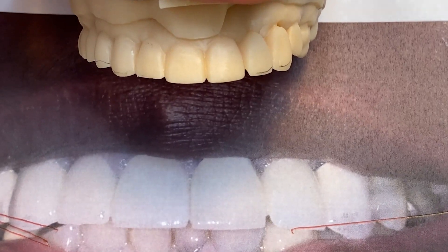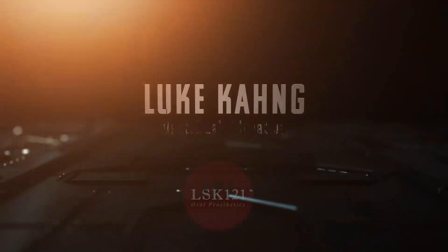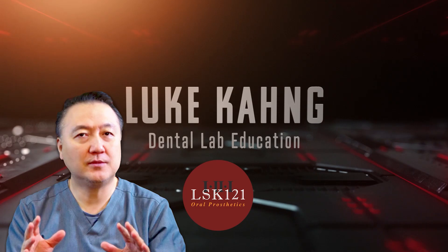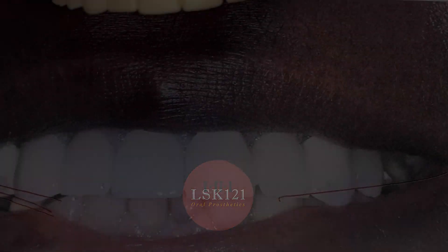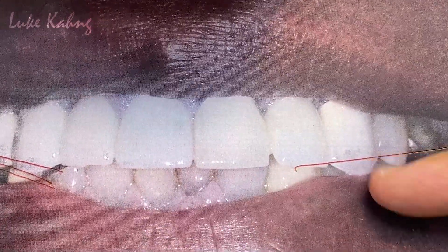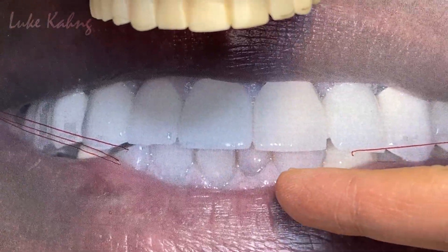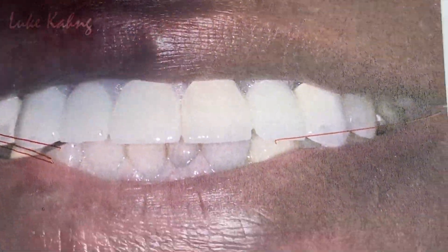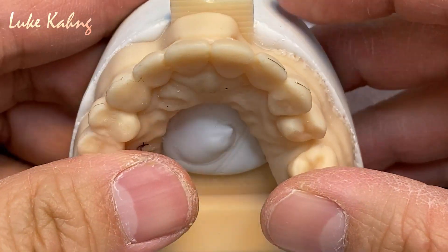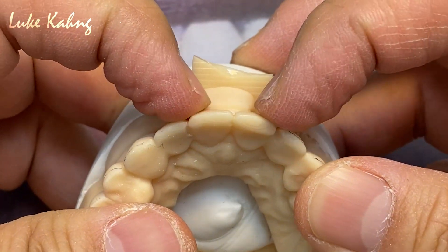First we can diagnose this from whatever the doctor sent us — the cases. This is the old PFM, and the teeth are already too tall, and there is color changing and discoloration in the lower area. So from here, first we have to make the alignment of the tooth — it's not flat — so it will make better contouring.